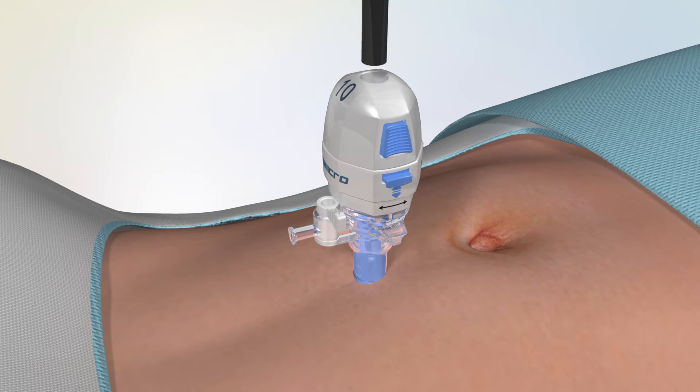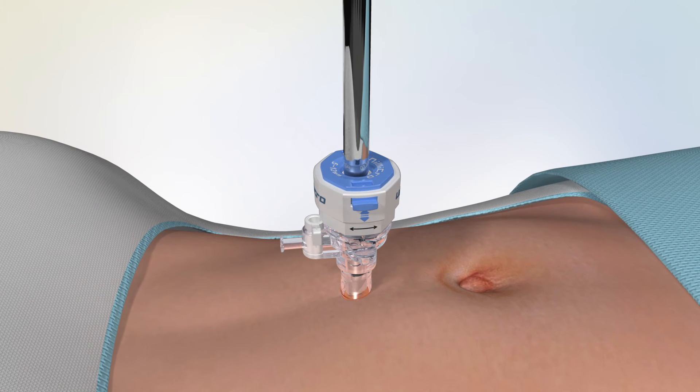During the surgical procedure, you may take out the specimen by pressing the side button of the handle.